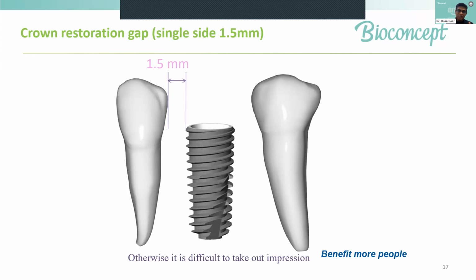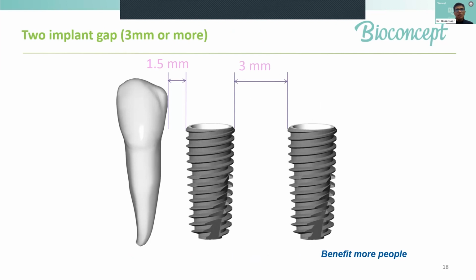Length would be easy to manage either through radiography, and similarly, if you do CBCT, that is a dental computed CT, then you can also see the width of the implant and decide what diameter would be best. And remember that we should at least have about 1 to 1.5 mm of bone all around the implant. And between two implants, you should have a minimum jumping distance of 3 millimeters. That is 1.5 from each side, each implant. That is how we come to the 3 millimeter figure.